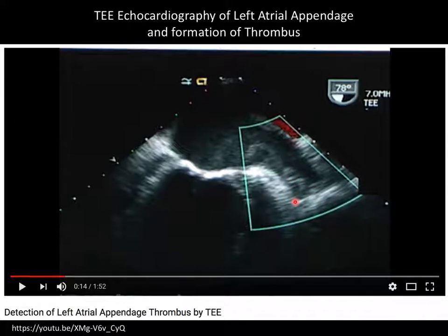So the first thing, what do you do then? You take the patient away for 4 days or whatever, and maybe it's a week, and you put them on drugs that dissolve clots. So these are blood thinners, and you do that first, and you come back and you make sure that thing's gone before you defibrillate the patient. So that's where echocardiography as an imaging technique gets inserted into a critical patient care pathway.